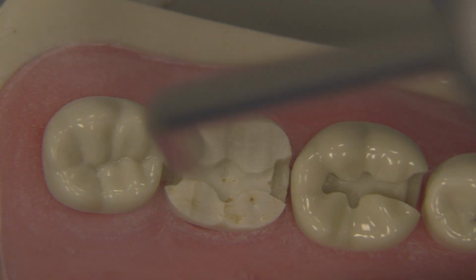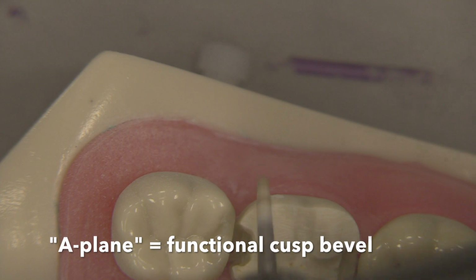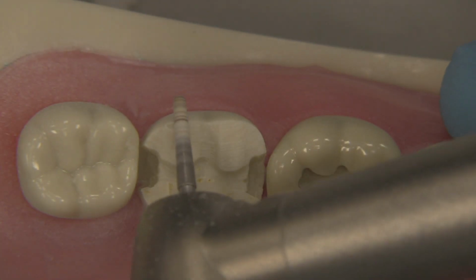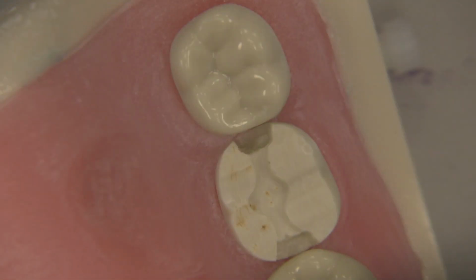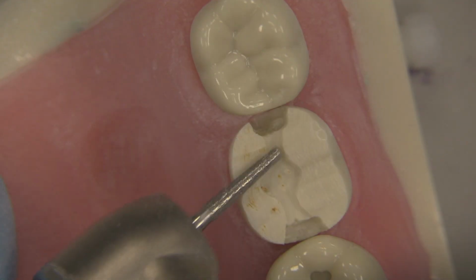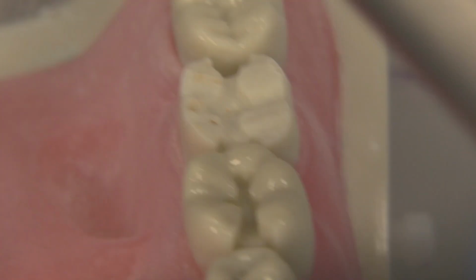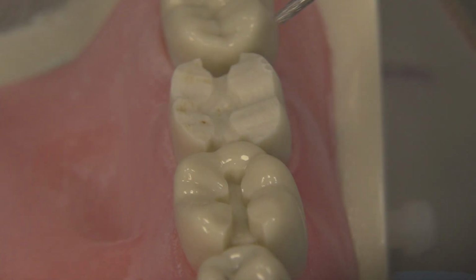Okay, and now we're going to do the A-plane. See the angle we used here? Use it here. The angle we used here, use it here. So whatever angle I used for this A-plane, C-plane, we're going to use right here. So the same angulation here is used here. You see that these are leaning in like they were originally. They're not flat.